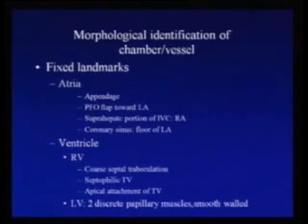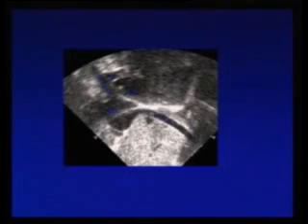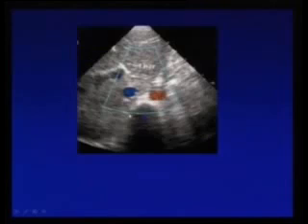Then on the LV I showed you two discrete papillary muscles, a smooth-walled septum, and a septophobic mitral valve. The mitral valve normally does not have any attachment to the septum, but rarely it can also occur. So that is not a very fixed criterion, but still two discrete papillary muscles and a smooth wall are more important criteria to identify the left ventricle. So this is situs solitus, because here we are doing sequential analysis in a patient with situs solitus. We have to define by the situs.